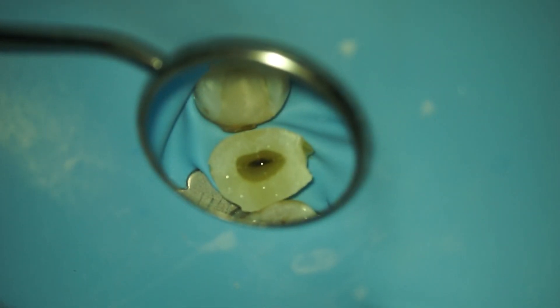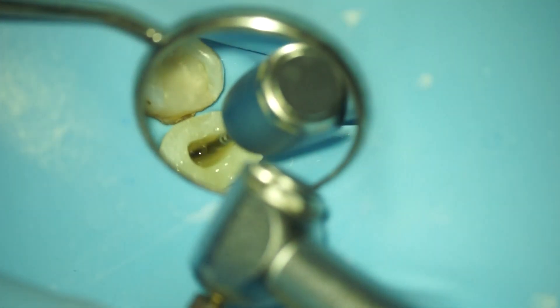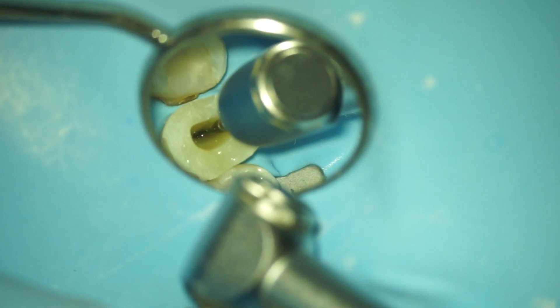In this part I left the sound on. This is the first part of the shaping process with the Procodile Q, and you will hear the reciprocating motion of this file.